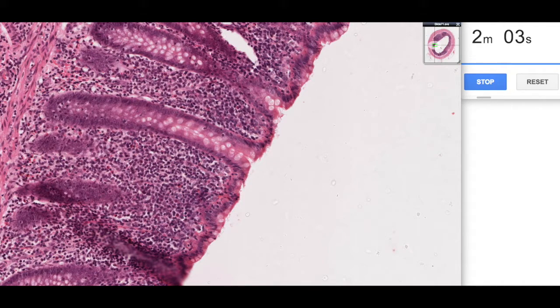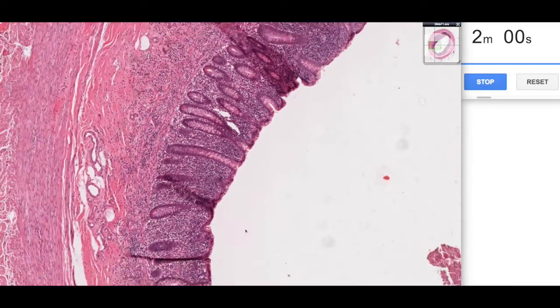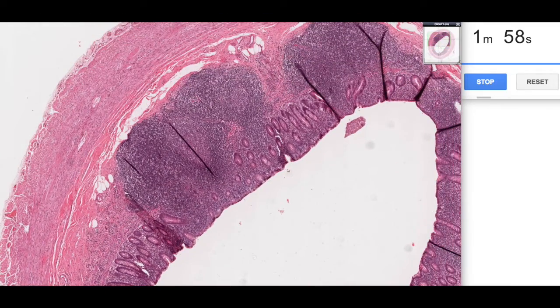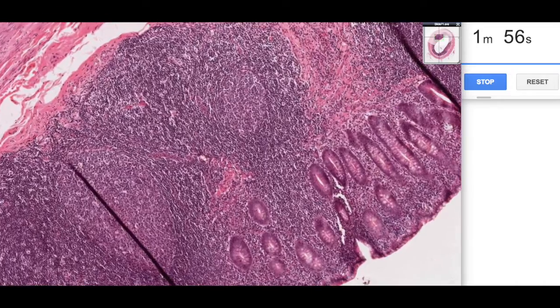Now all of these are lymphocytes. If we sort of zoom out a little bit, we can zoom around and see little features of these lymphoid follicles.